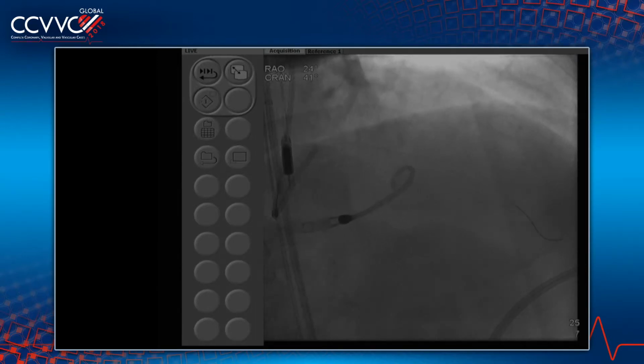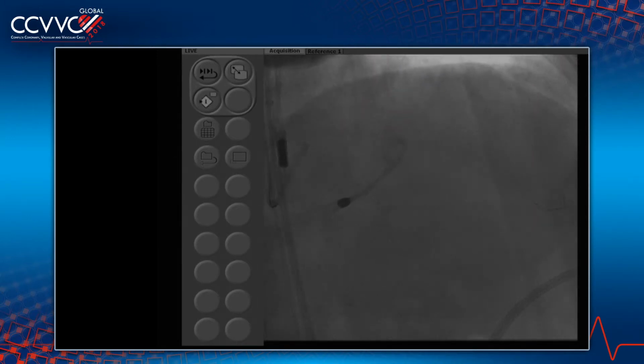But I do think that in a patient like this with 3-vessel disease, poor LV, and honestly, the films we reviewed before coming in here, it really does look much better than it did when we looked at it together. Dr. Sharma. And not only that, this patient was supposed to go for surgery. Patient has a surgical consultation. Roxana, now with this information, how do you feel about the adenosine, with the Impella? That's a good question.